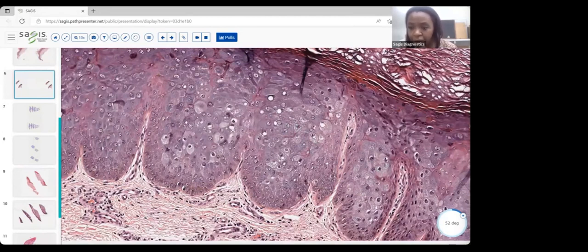So there is a bit of a halo, a perinuclear halo. And the nucleus itself may have some inclusions, fine, no problem. We can see that there are inclusions inside the cytoplasm too, where we have this basophilic coloring. But just the mere size and the color of these keratinocytes is essentially quite diagnostic. So this is going to be EDV, epidermodysplasia verruciformis.